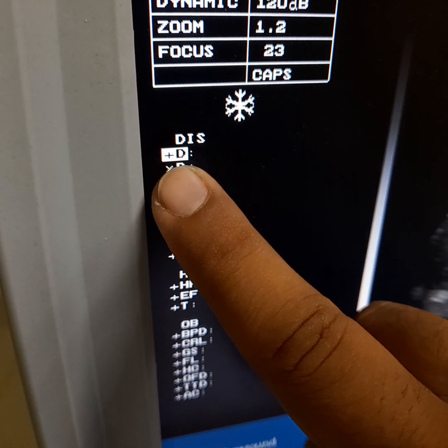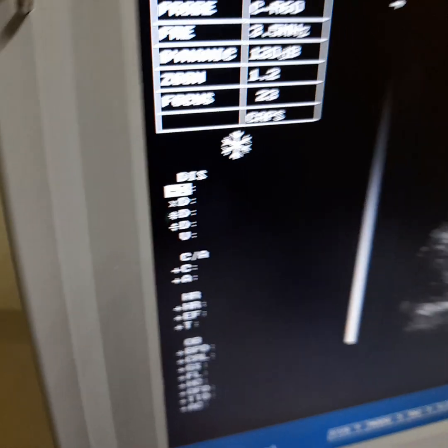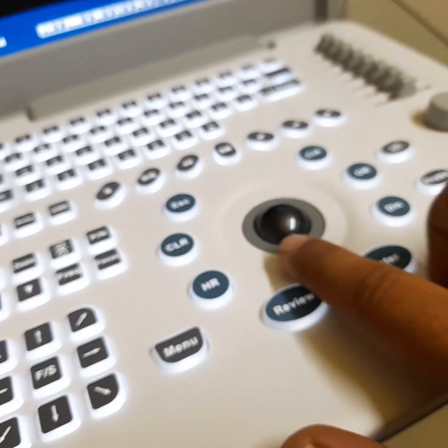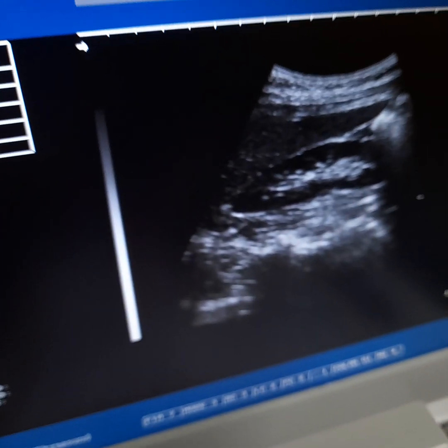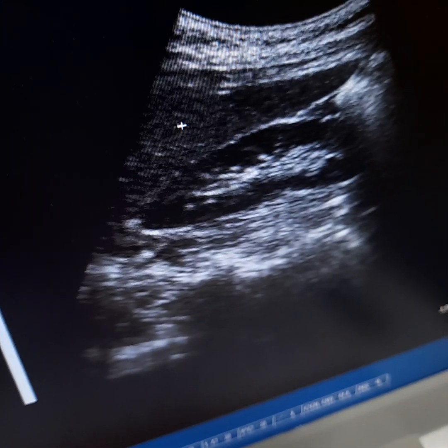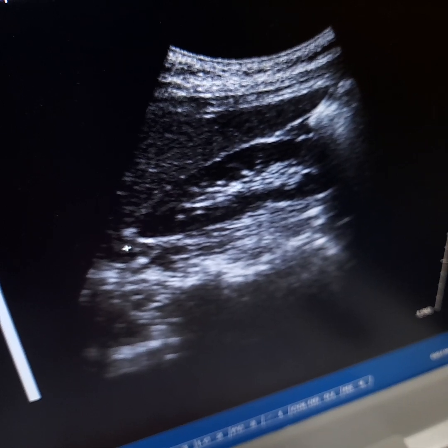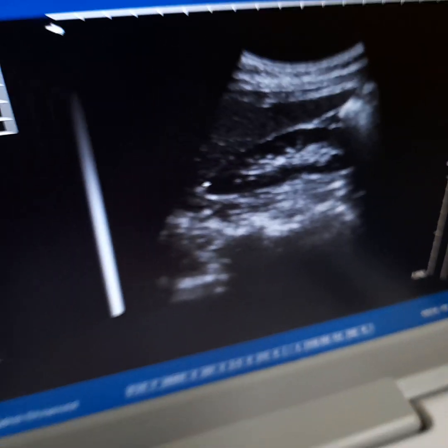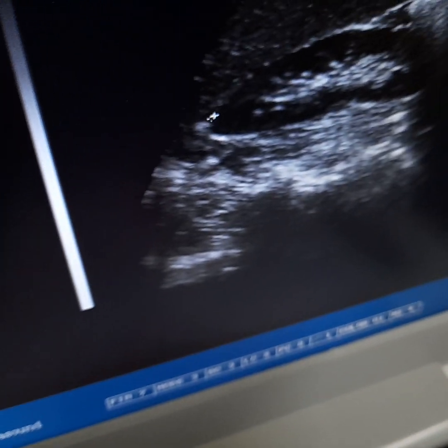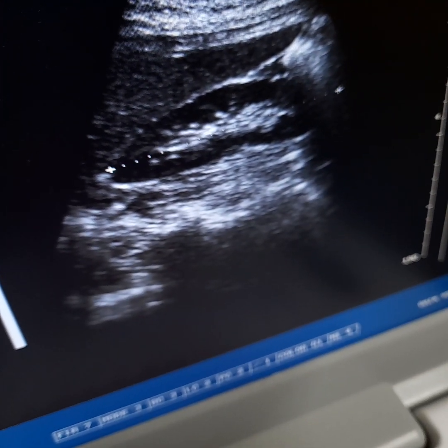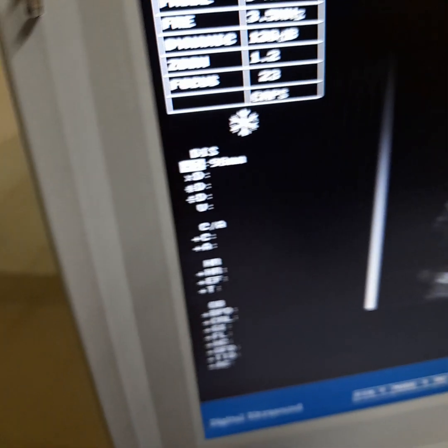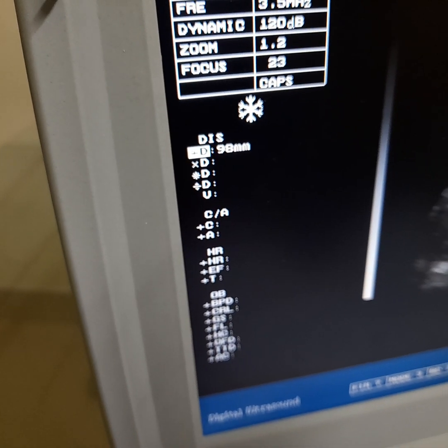The first distance point is now highlighted. Move your trackball to position the cursor. Set the first point and then press Enter, then move the trackball to the other side to set the second point. The measurement result is 98mm.